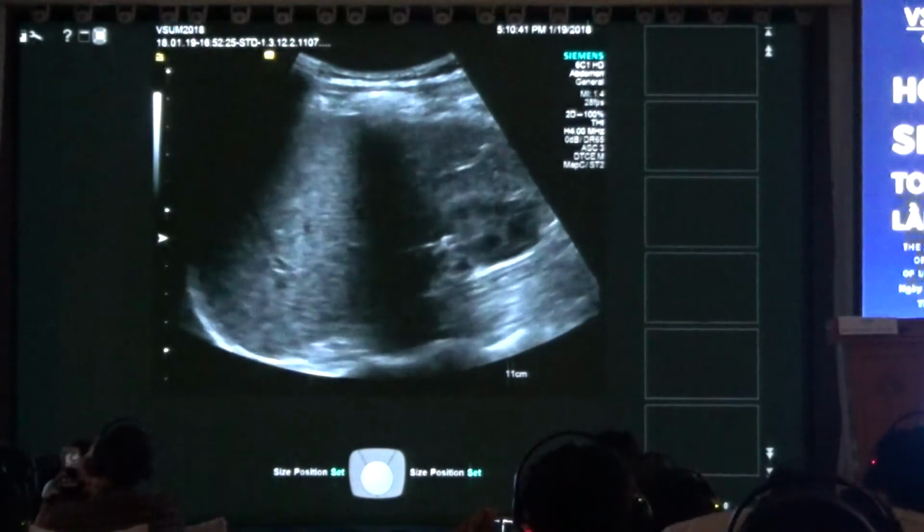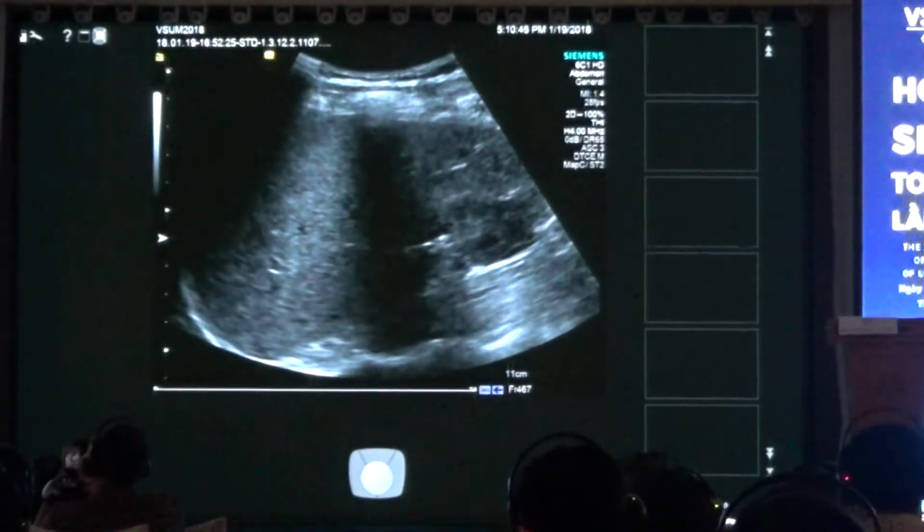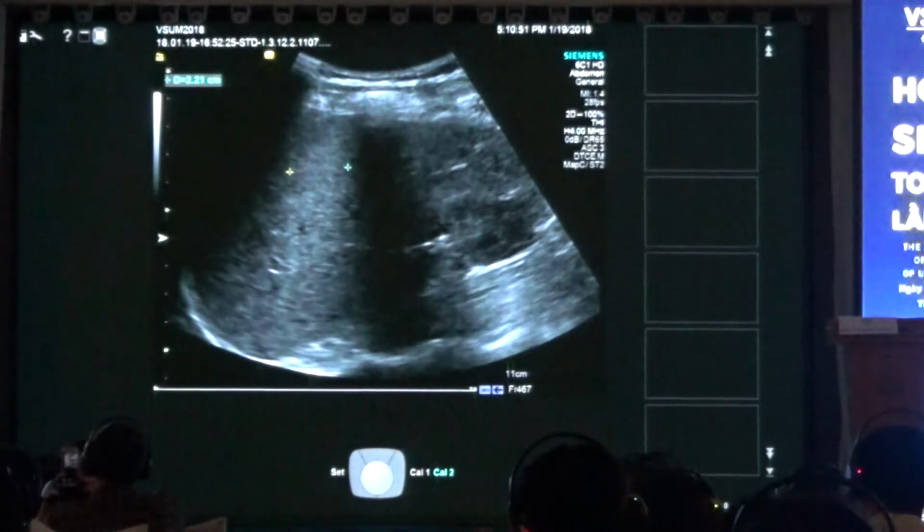But it might depend on the height of the person. Second, if I'm looking right now, in between the ribs, that I have a window right here of about 2 centimeters. It does not look too good. So there are a few things which I'd like to improve right now, because if I go for the FibroScan position, it seems not to work very well.